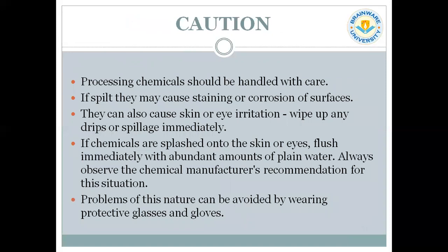Finally, these are a few cautions you have to maintain at the time of developing by automatic film processor. Processing chemicals should be handled with care. If the chemicals spill onto any surface or floor, they will cause staining of your clothes also.